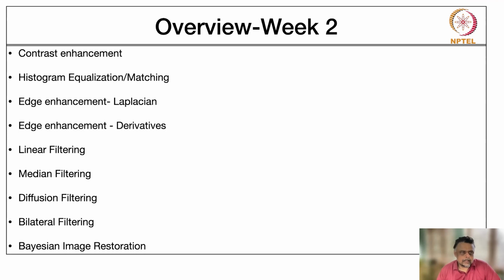The next technique that we look at is called histogram equalization or matching. Once again, this is done to improve the appearance of the picture. Okay, so the first one is more trusted. The contrast enhancement, what we call setting the window and level, is more often done because it doesn't really change the meaning of the image, but histogram equalization can. Histogram equalization is good if you're going to do further downstream tasks. Okay, so we'll see what histogram equalization does when you look at the process.